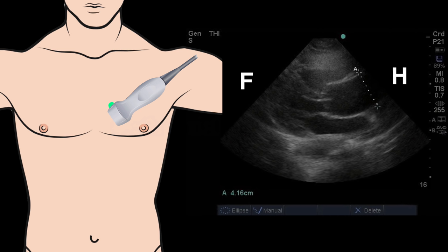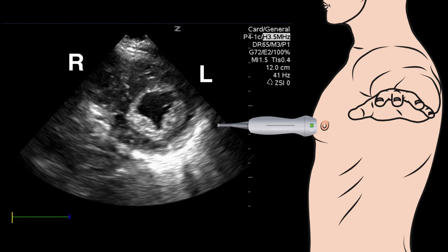Cardiac orientation is slightly different — the indicator points towards the patient's head or their left side, specifically the superior portion of the heart. Because the heart is an oblique structure, we are sagittal to the heart rather than the external anatomy. The indicator may point toward the right shoulder externally, but on the image it is pointed towards the top of the heart, giving a sagittal view of the heart. In a cardiac transverse view, the indicator is oriented towards the patient's left side so you can see a transverse cut through the left and right ventricles and identify them by probe orientation.